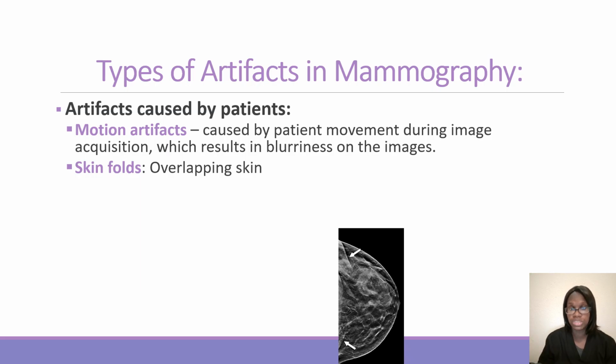You do not want to jeopardize the patient's breast tissue whenever you are doing this, because you can jeopardize tissue that should be on the mammogram image when you're trying to get rid of the skin fold. So what I find works best is, whenever I'm swooping it, I'm still holding my other hand taut on the breast and also compressing the breast tissue while I'm swooping out that tissue, or I throw in an XCCL picture to help with that.